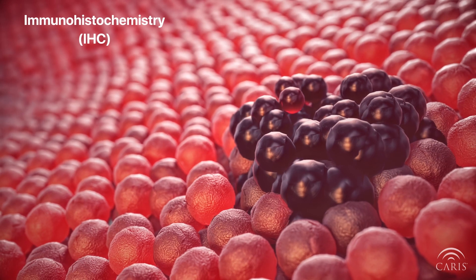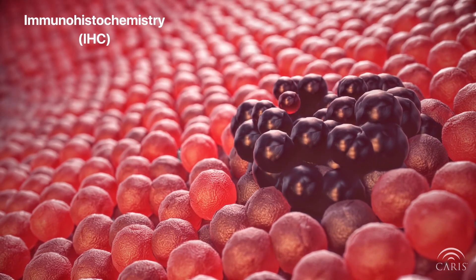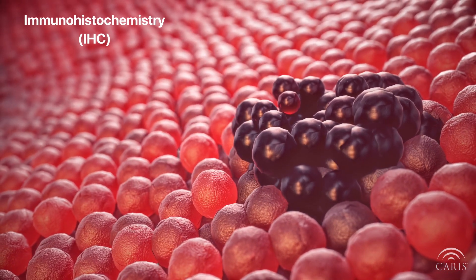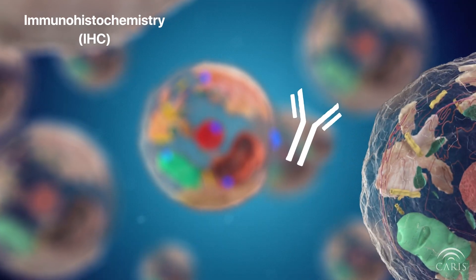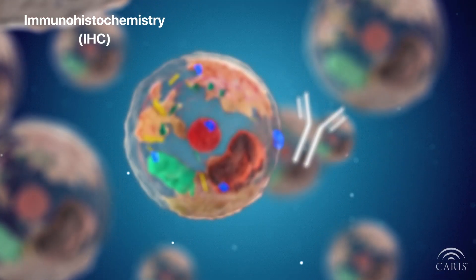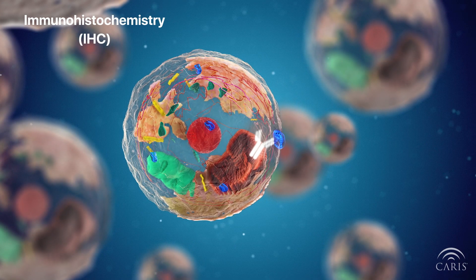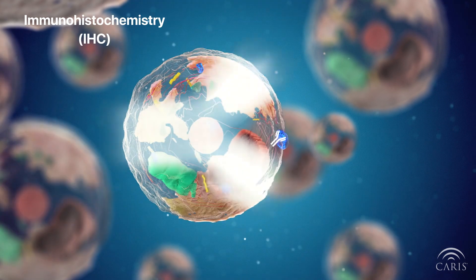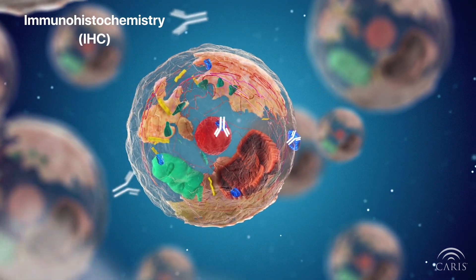Immunohistochemistry, or IHC, is a common laboratory test used to diagnose cancer. IHC utilizes modified antibodies that recognize and bind to specific proteins in and on the cell.